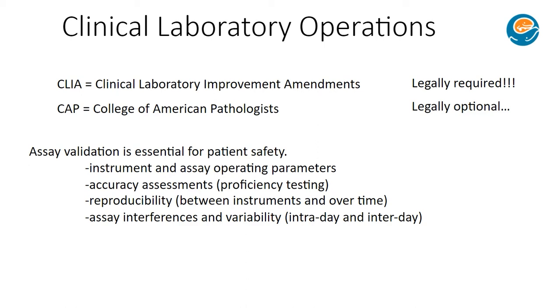We're graded, we're compared to peers, both in terms of methodology and other clinical laboratories. And we regularly monitor for changes in the behavior of our instrumentation. So we run daily control samples, normals and abnormals, to make sure that we are as consistent as possible.